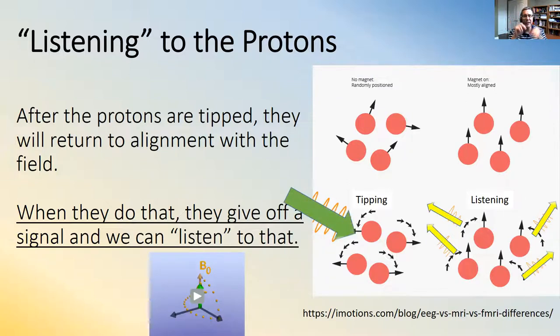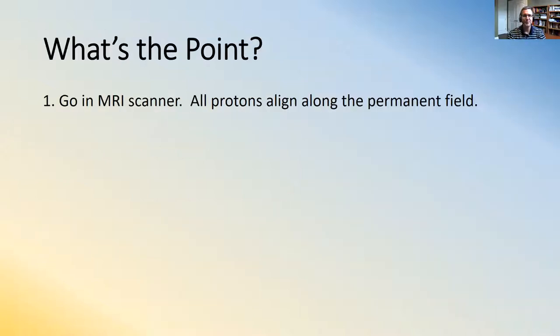So that's what I mean by listening. It's not listening in the sound kind of sense. It's electromagnetically listening, but it is at a radio frequency. So it is like they have turned your body into a radio transmitter. They really have. The MRI has turned all the protons in your body into a radio transmitter. It's now beaming out a signal that they can listen to right inside the machine. It sounds like magic. It is not. It is science. It is amazing. And it is incredible that this works, clearly deserving of a Nobel Prize. No doubt in my mind.